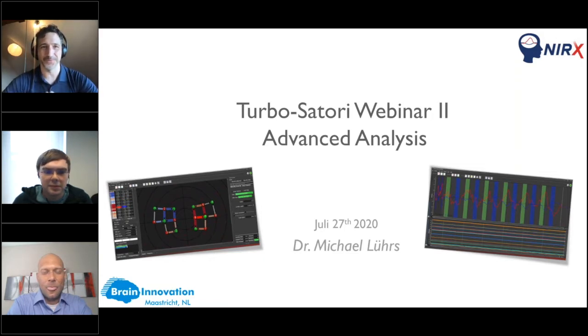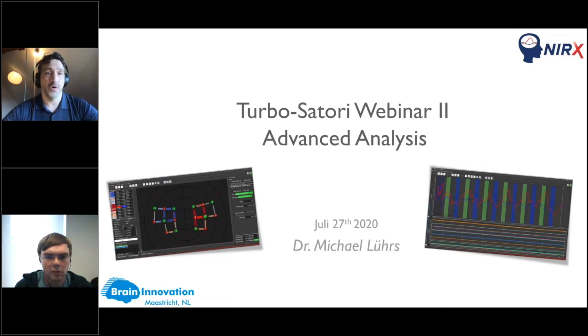Dr. Michael Lührs from Brain Innovation, the person behind the commercial software. It's a company that makes software, mostly known for their fMRI software, Brain Voyager. Sometimes you want to focus on your research. You don't want to be an expert on that, or find somebody who can program.